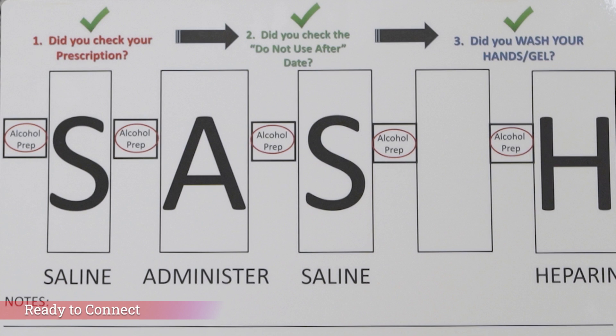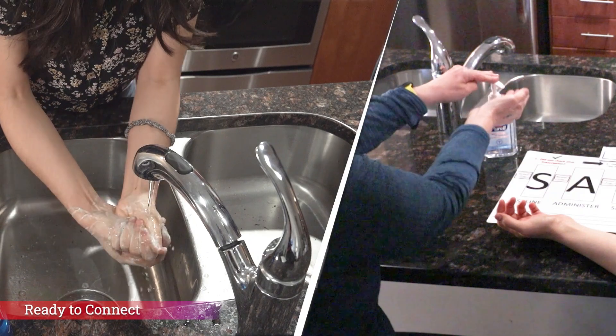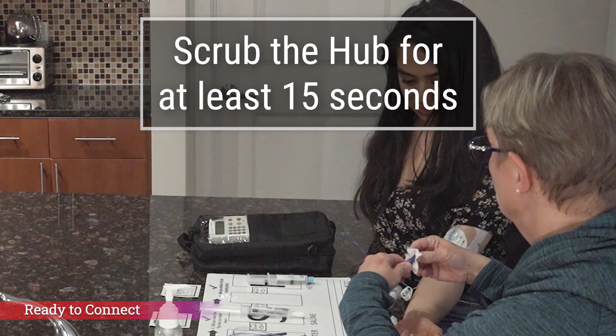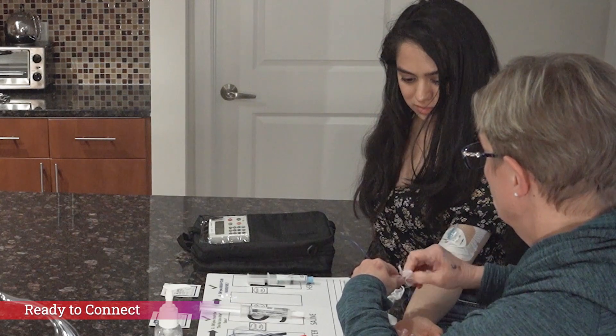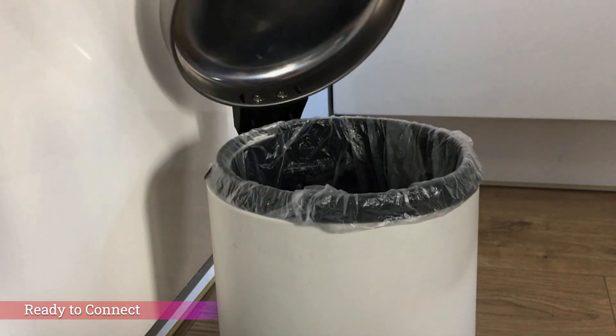Now you're ready to connect your medication tubing to your IV line. But before you do, check to make sure that you have answered the three questions found on the top of your sash board: Did you check the prescription? Did you check the medication expiration date or the do not use after date? Did you wash your hands? Go ahead, wash or sanitize your hands for a full 20 seconds. Now you must scrub the hub again for at least 15 seconds. Use the next alcohol pad on your sash board, the one before the A. Unwrap the pad and wrap the alcohol square around and over the hub while applying friction, just the same way we did before. Remember, we call this scrubbing the hub. When done, throw out the used alcohol square.